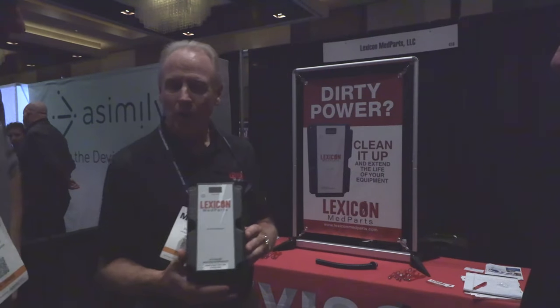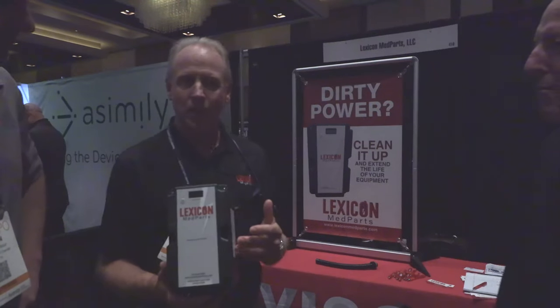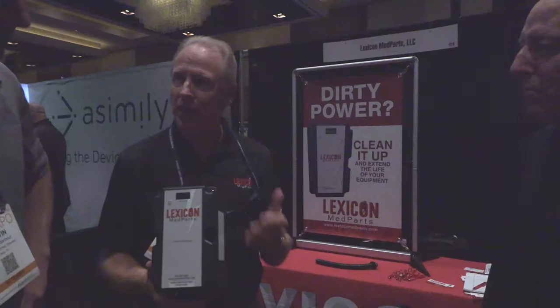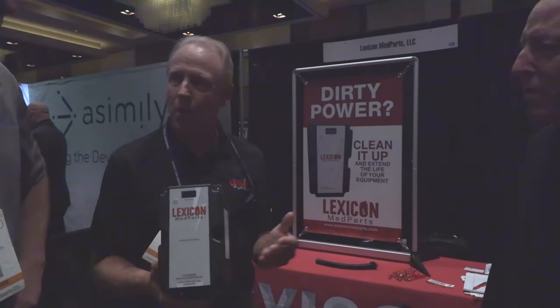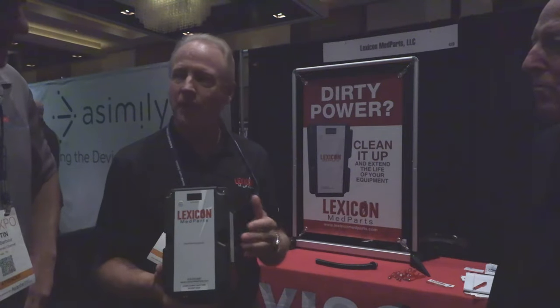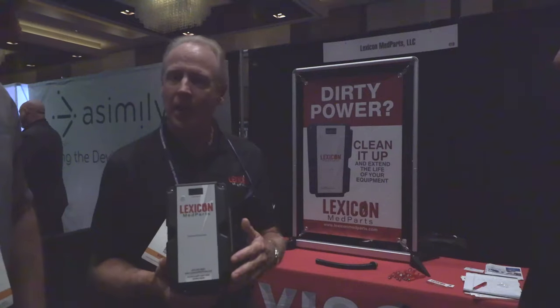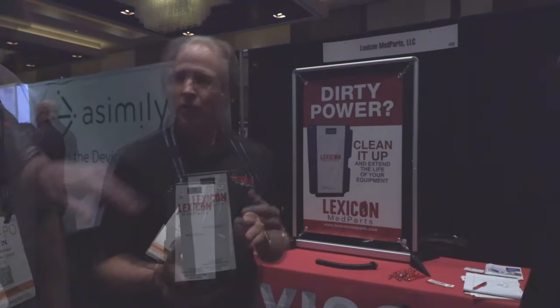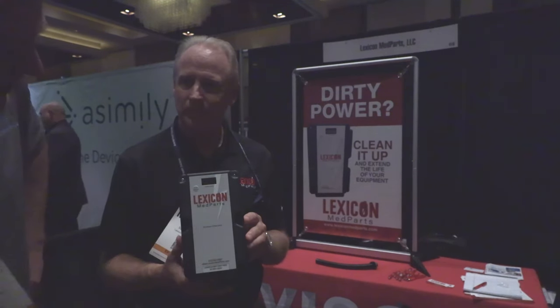So if it's for all imaging equipment, what configurations and voltages can this handle? We put this on any and all imaging equipment — these things are not sitting on the shelf, they're made to order. We break it down into a couple categories: we want to know what your power is, whether it's 208 or 480, and then from there we break it down further for the wiring. It's three-phase wiring and it can be wired neutral or non-neutral, and it comes with the ground.